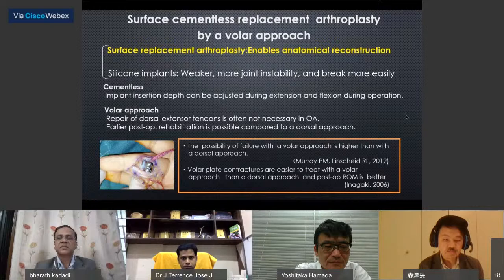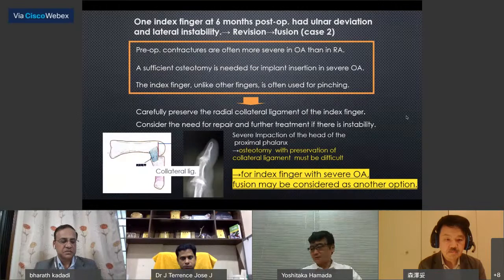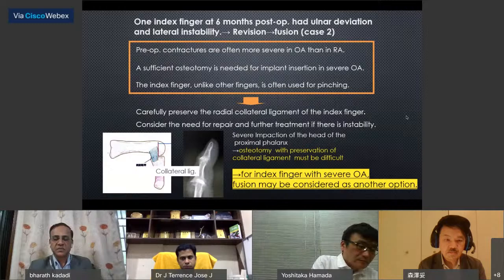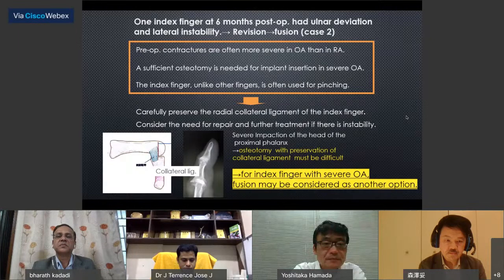As to case 2, one index finger had ulnar deviation at 6 months post-operation, and a plain X-ray showed implant loosening and sinking. Usually, preoperative contractures are often more severe in osteoarthritis than in rheumatoid arthritis. During osteotomy, it is necessary to make sufficient space for implant insertion, but when OA is severe, the collateral ligament is sometimes unable to be completely preserved. This can result in ulnar deviation and radial instability.